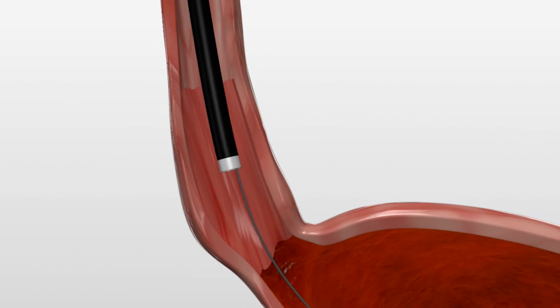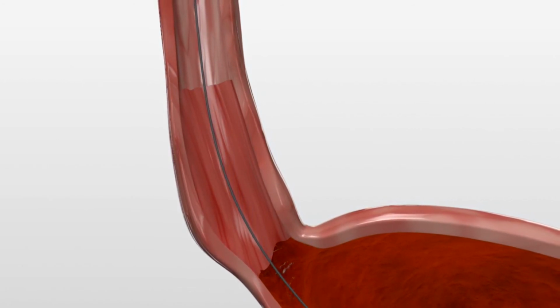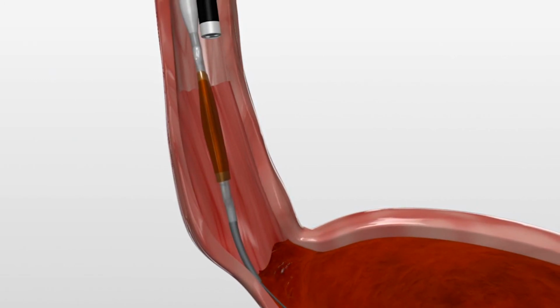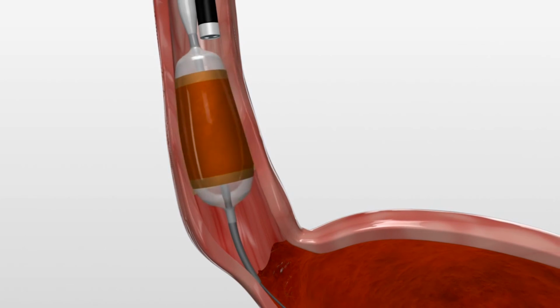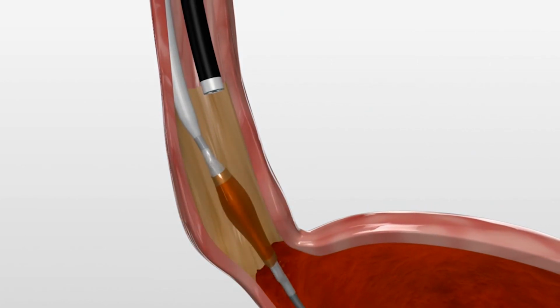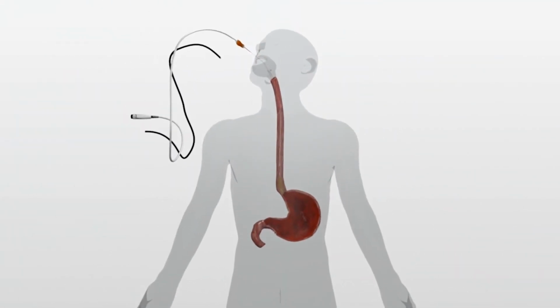Please bear in mind that the esophagus regenerates quite fast. Almost all of the work that we've done here won't be noticeable in a matter of 1 to 2 weeks. So we repeat the endoscopies periodically just to make sure that the area of Barrett's is disappearing. This may require several sessions until we have completely eliminated the Barrett's surface mucosa. If you know you have Barrett's esophagus or you suspect that you may have Barrett's esophagus, it is very important to schedule a consultation so that we can discuss all the details.